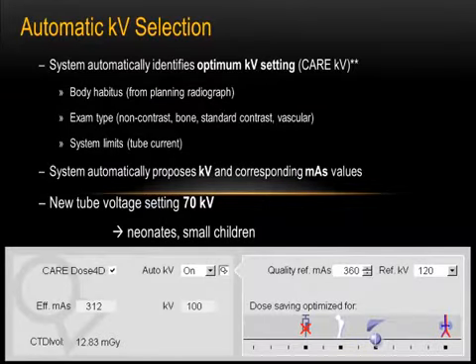Okay, well, in the morning, we heard from previous speakers that they discussed this automatic kV selection technique. I know Siemens has it, and I also know that GE plans to release this. I do not know about other vendors' plans, whether they have one or are going to release one, but it basically looks at the patient's size, looks at whether this is going to be done with contrast or without contrast, and then picks the right kV. It does increase the mA a little bit because you have just dropped the kV, so in order to keep a reasonable contrast-to-noise ratio, it would increase the mA.